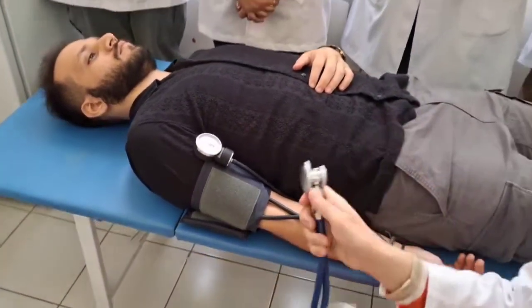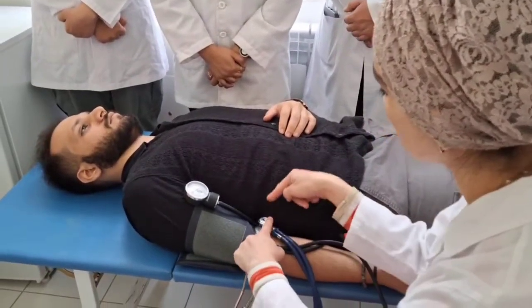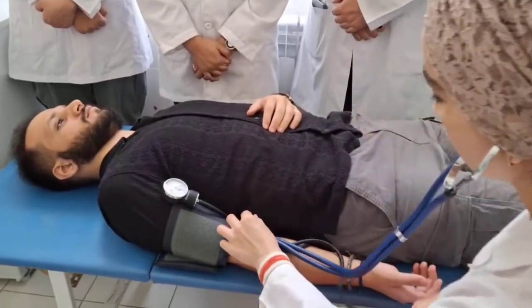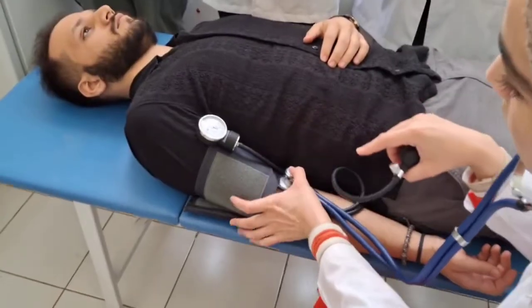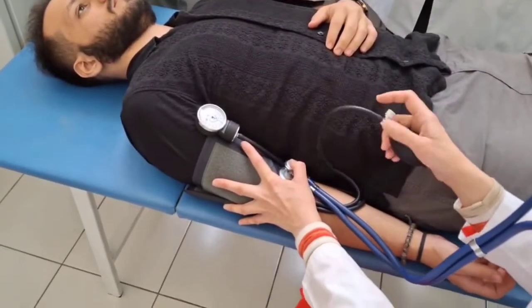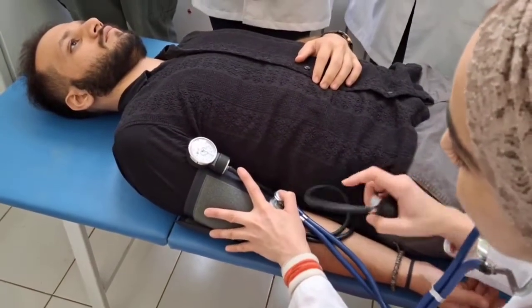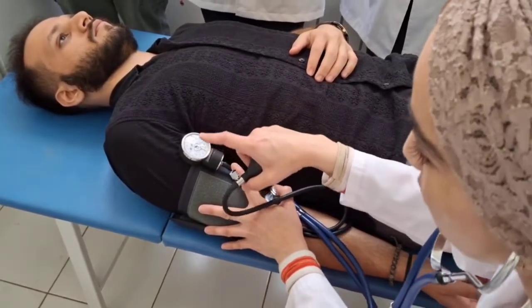I will place the stethoscope on the middle part of the cubital space. We should pump air into the cuff — it will increase pressure on the manometer. I will close the valve and pump until disappearing of pulsation sounds, then add 20–30 millimeters more.